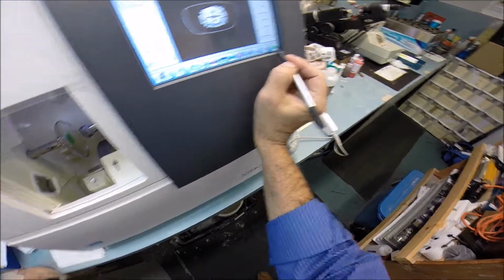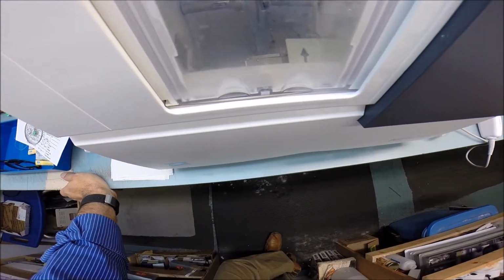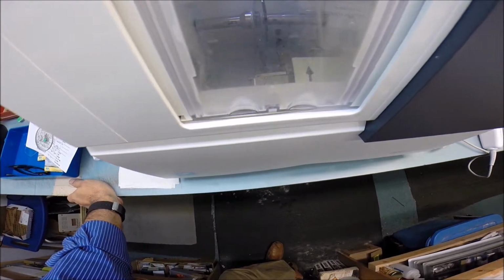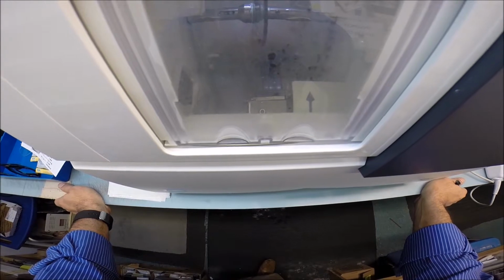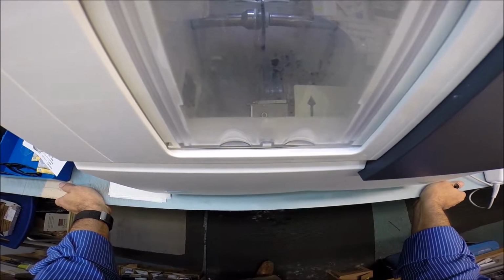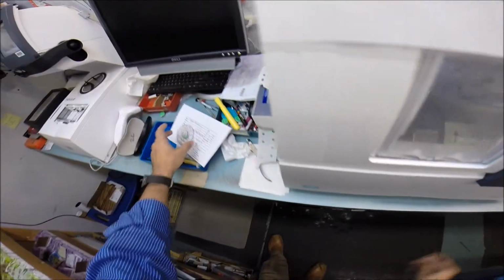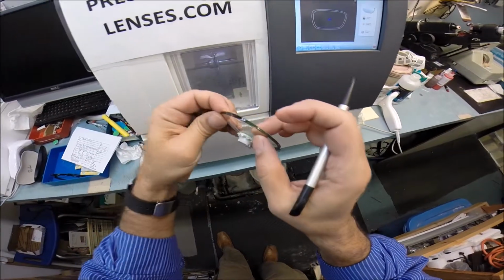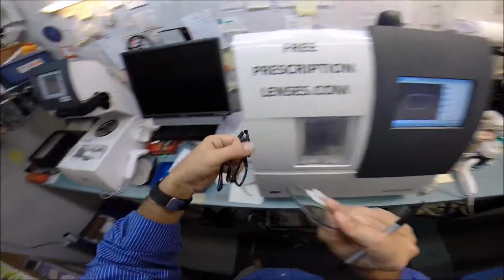I'm going to hit this green button, and when I do, the door is going to close. The chuck is going to clamp down. And then next there will be 2 white styluses. They're going to come down, and it's going to trace the shape of the right side of your frame onto the lens to make sure the lens is large enough to fit, which it is. But it's also measuring the thickness of the lens as it goes all the way around to know exactly where to place the bevel so it will fit best inside your frame.